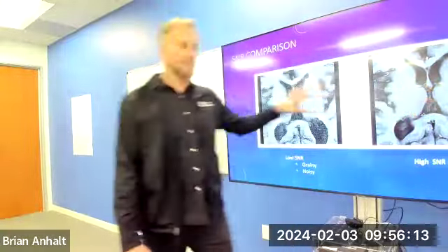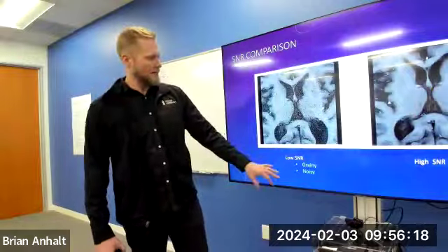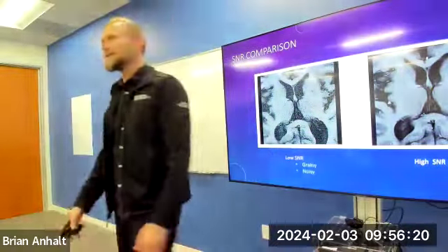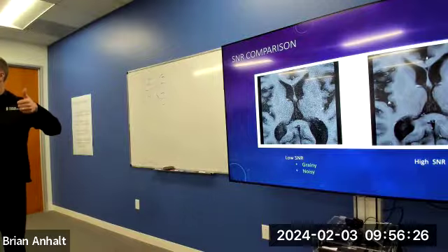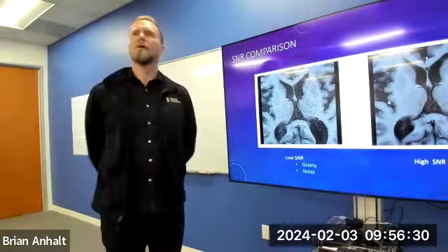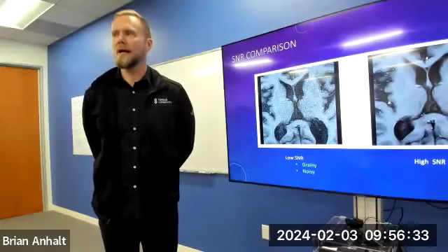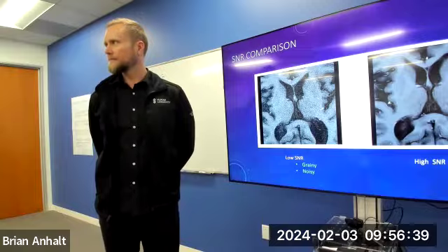This doesn't look like that, right? Hopefully you can tell the difference. The reason I'm giving you this verbiage is because I might say, this image looks grainy, what do I need to do? The image looks noisy, what do we want to do to fix that? We want to do something to improve the SNR, right? So if an image is looking like this, you as a technologist know, if I want that to go away, I have to do something to get better SNR. I need to raise my signal or lower my noise somehow, right?